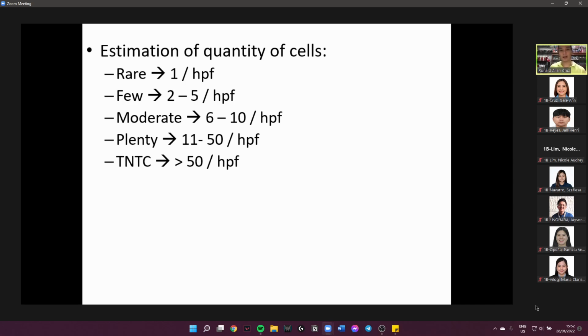Typically, a normal WBC count is less than 5. 6 to 10 is pushing it. It depends on your clinical practice. For OB-gynecologic patients, sometimes with 6 to 10, some doctors would already give antibiotics even though the patient is asymptomatic, because females tend to have a greater rate of UTI compared to males.